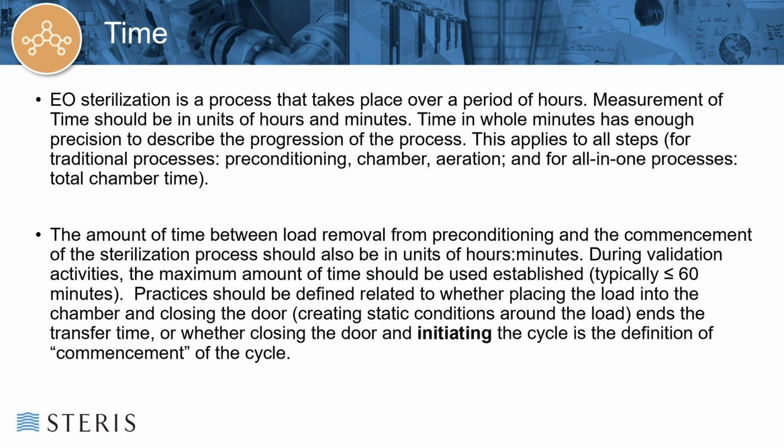For time, you want to make sure not to over process your product any more than necessary. So you do want to try to establish the minimum time and give yourself some cushion on the back end so that if the cycle runs short, you still have your lethality proven, but if it runs over, you have data to support that the product is not damaged. For time in EO dwell, you would also need to have EO residual data to show that your product is not going to retain EO any more than it would in a normal process if it's been over-processed during EO dwell.